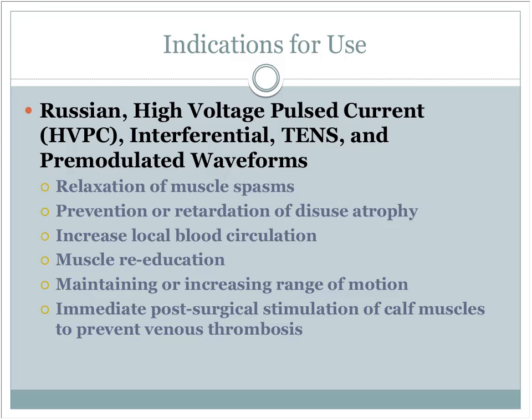You can improve healing, not just of wounds, but even of a mostly healed and very stable fracture, because along with most fractures, there's also soft tissue damage that occurs. It may not be a compound fracture where it's poked through the skin, but underlying that, there's damage to tendons and fascia and all kinds of things. So you can increase local blood circulation to help heal that area.